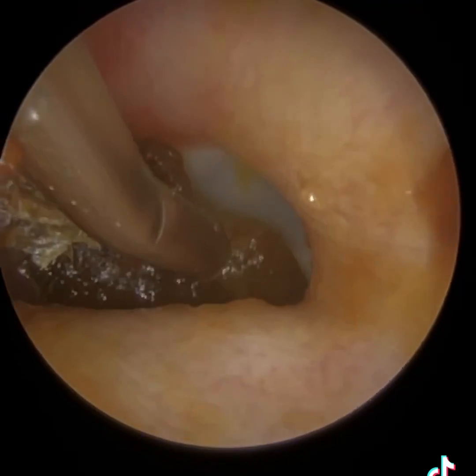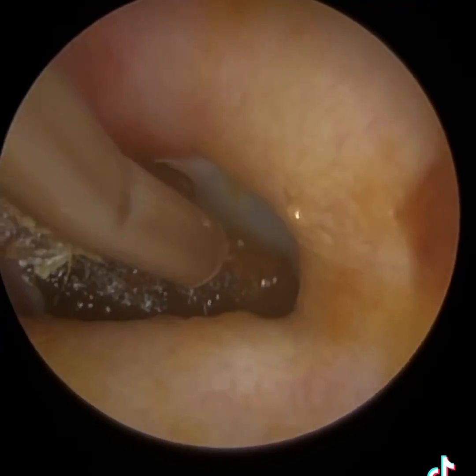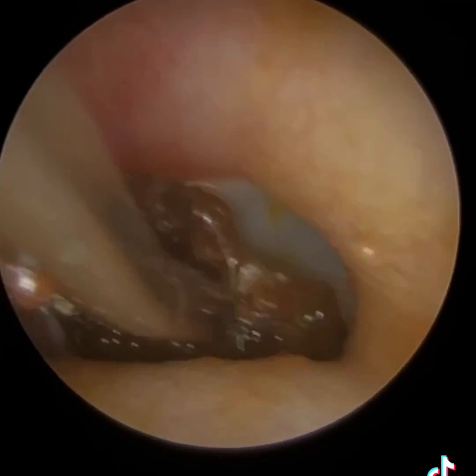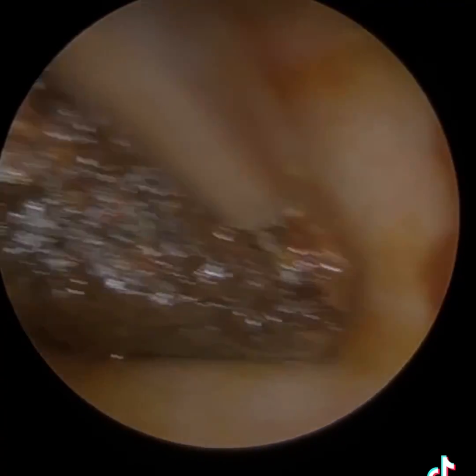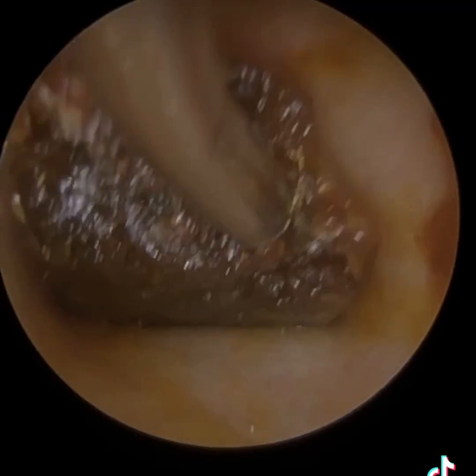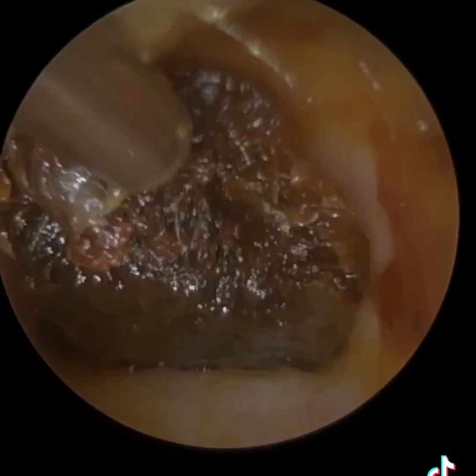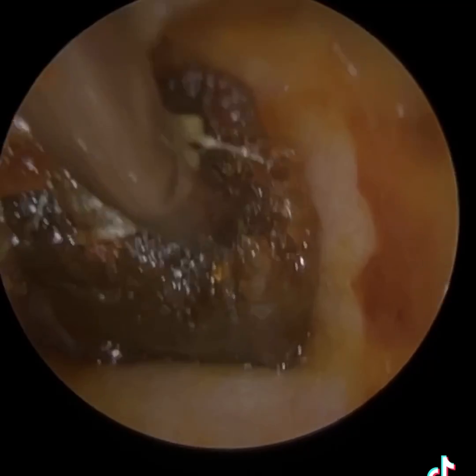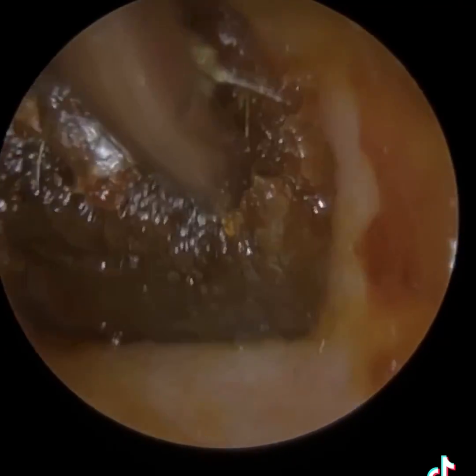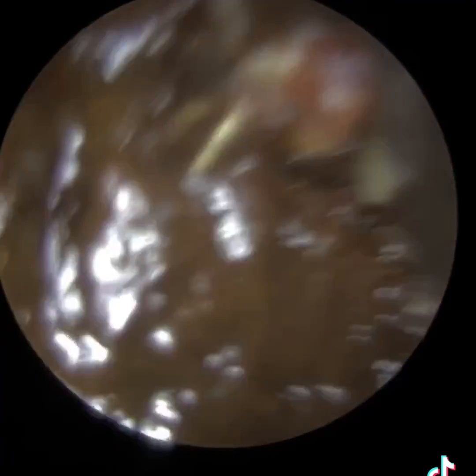It's a sticky type of wax, so this can be a bit tricky to remove, because if you go in too much with the sucker, it embeds within the soft wax and blocks the tube, so you don't get a suction grip. So you have to somewhat hover over the wax plug, and you can see I've released it from the narrowing of the ear canal. I've just lost the suction grip here, so I'm just going to hover over and we're going to remove this.